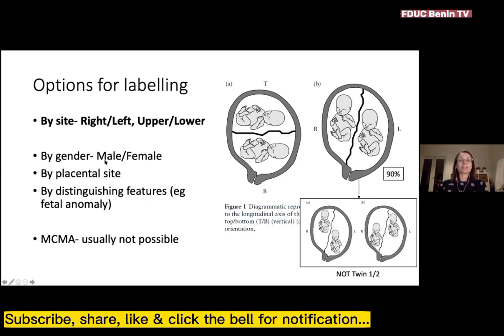There are occasionally other ways of working out which twin is which at each scan, but they're not always useful. So if the twins are a different gender, if they have placentas that are completely separate and on opposite sides of the uterus, or if they do have a fetal anomaly that's easy to distinguish at each scan. And for MCMA twins, it's not usually possible to determine which one's which, because they're always the same gender, they're in the same sac, they can move around the uterus, and they won't stay to the left or the right of the uterus. So it is not possible to confirm for sure which twin is which.